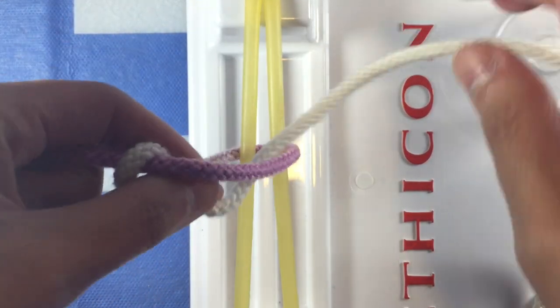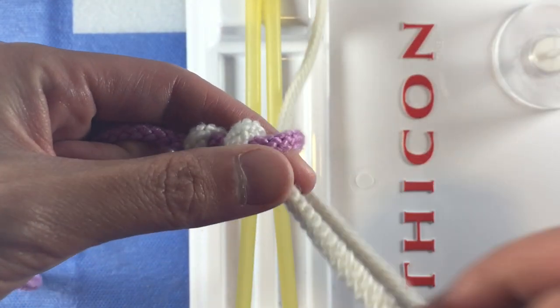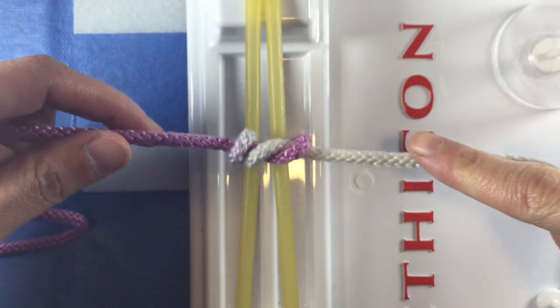All this is, is to wrap the rope or suture not once but twice on the first throw. Then continue as you normally would.